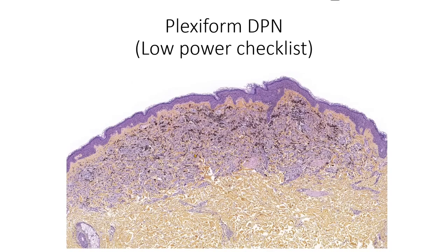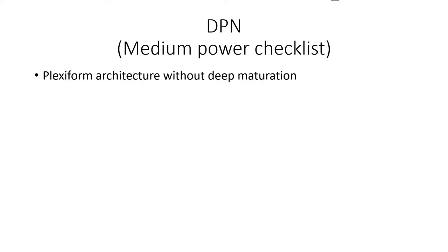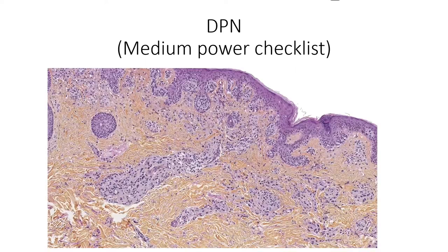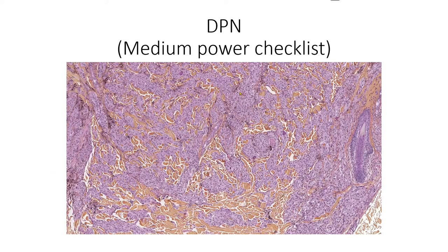For the plexiform DPN, there is no clonal aspect. You only have a horizontal plexiform architecture, and you still have the grid of melanophages. On medium power, you're only going to focus on the plexiform architecture without deep maturation. So you have fascicles here, and you'll notice they're exactly the same from top to bottom.